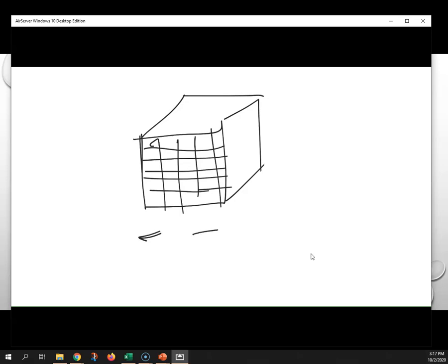lateral dimension and the elevational dimension. And in fact, Philips makes a probe like this. This is a 2D probe. Philips makes a probe called the matrix probe, and it is capable of imaging longitudinally and transversely all at the same time. It's really kind of cool. I want one, but they're about $40,000, so I'll wait for a while.